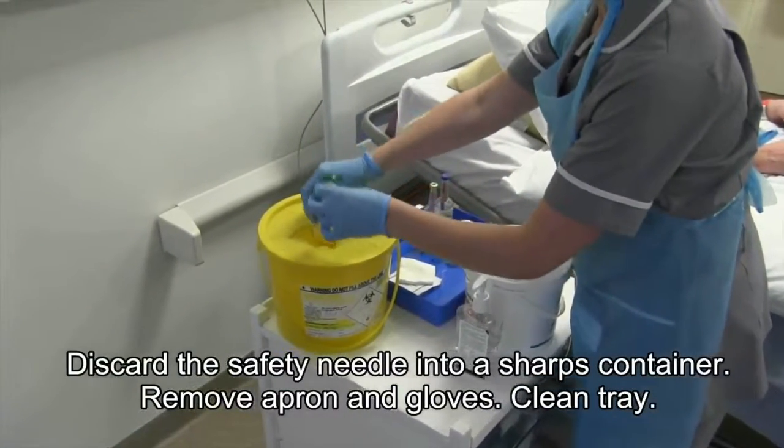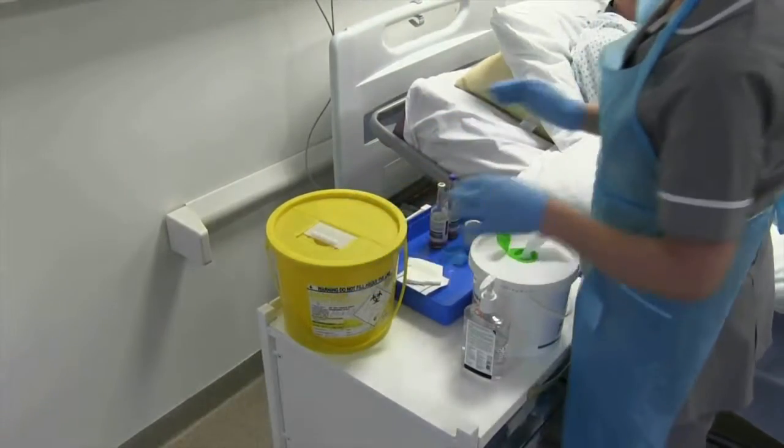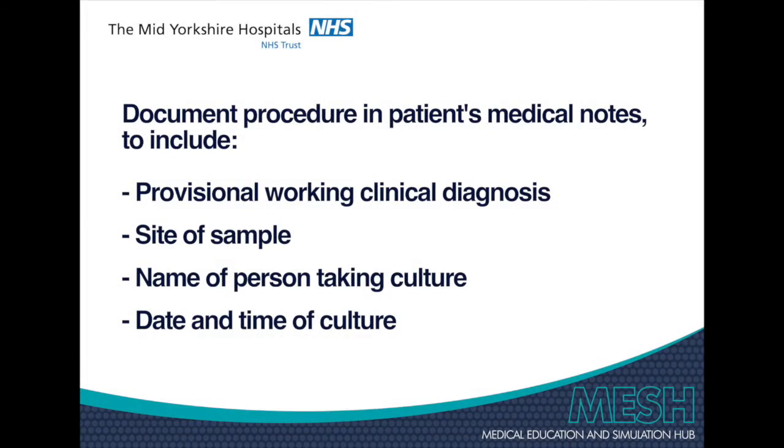Remove apron and gloves, then clean your tray. Document the procedure in the medical notes. Thank you.